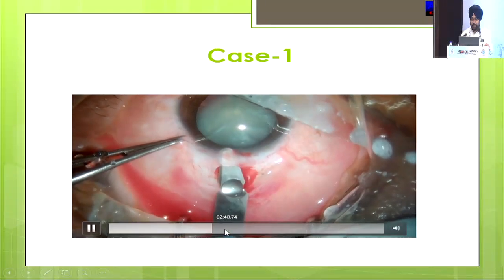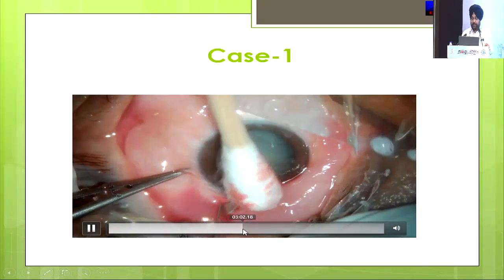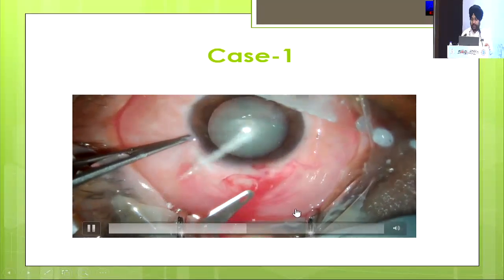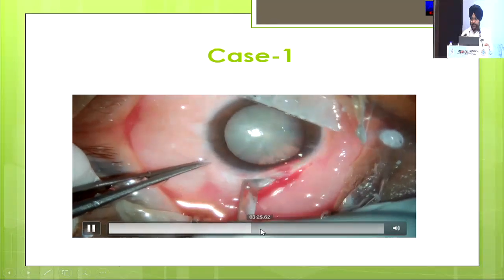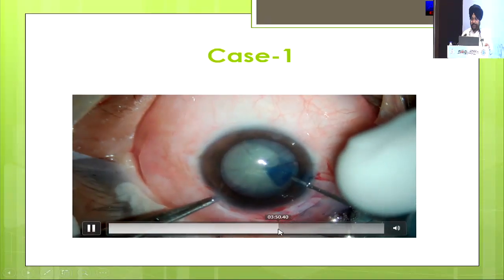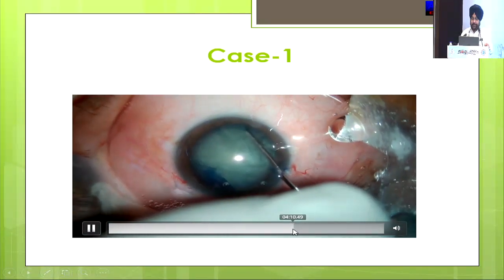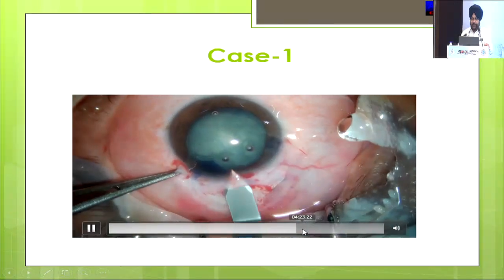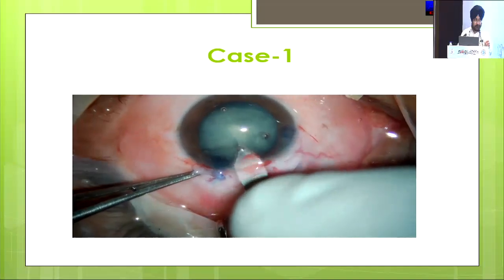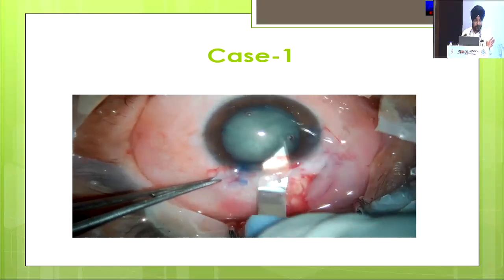The tunnel is almost complete. CCC is as usual. I mostly prefer to do it from the side port, then hydrodissection. After that I enlarge my incision — I am using a 2.2mm keratome. So practically the outer incision is approximately 2.2mm.